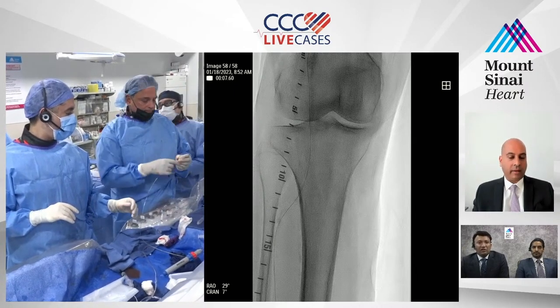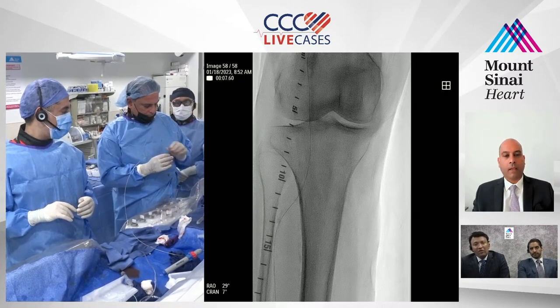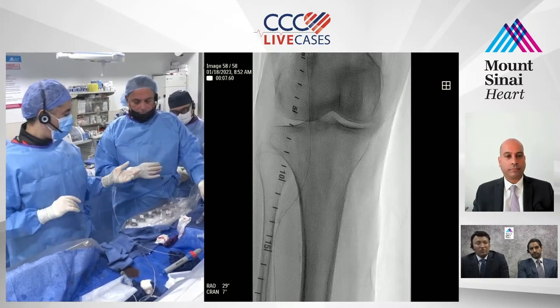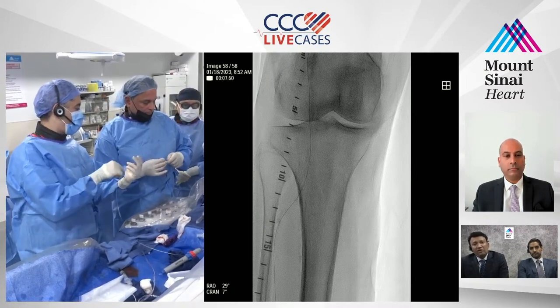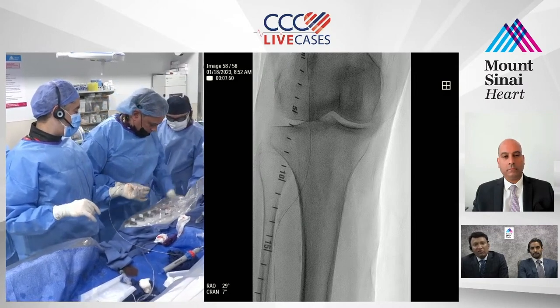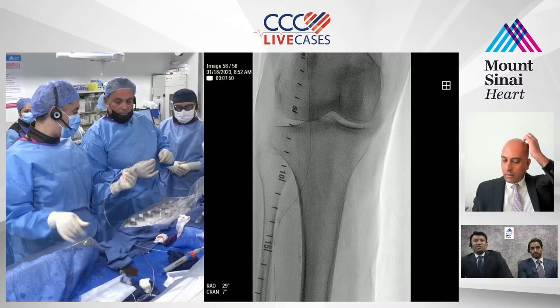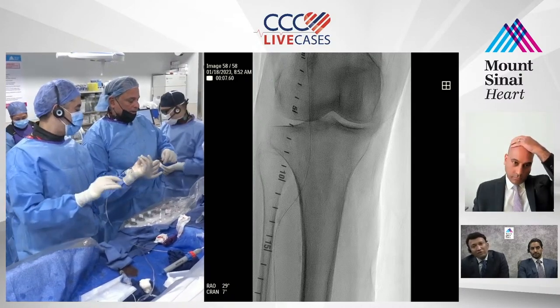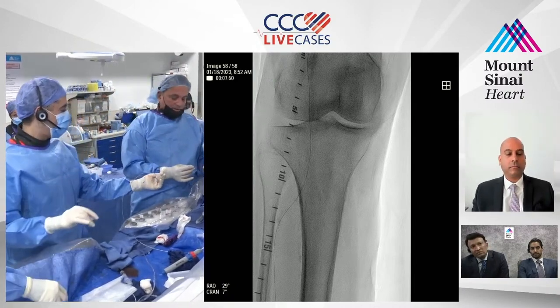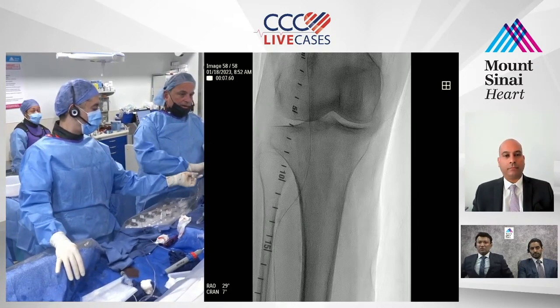Yeah. The question is that the advantage of doing a Cook sheath is when you go from below, you can do the intervention from below. And you can take the Cook sheath out when you're doing a Shockwave there. So that way the access site is sealed. You don't have to worry about it. I think she's a thin lady, so it should not be that difficult. Like the hematoma chances are also much less. Well, if we cross, we can always leave it, or balloon tamponade it or something. Yeah, that's what I'm saying. Sorry, if it's 2.4.